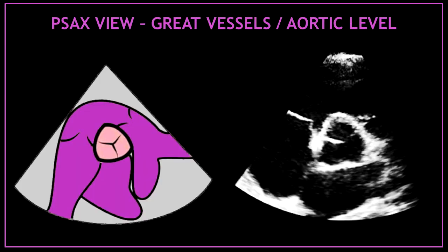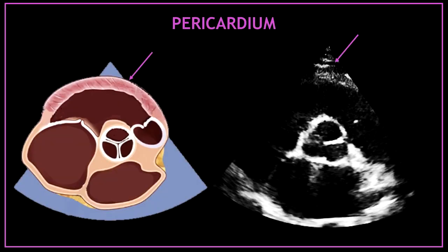We are going to focus only on this view, which is called the parasternal short axis view at the great vessels or aortic valve level. The first structure is the pericardium. The pericardium corresponds to that very anterior, thin, and bright line.